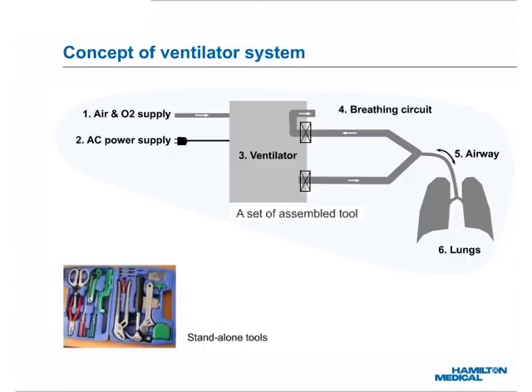The ventilator, therefore, is just one of the parts required for ventilation. It can be compared to a wheel of a bicycle. If not properly integrated into a system, a ventilator alone can do nothing about mechanical ventilation. This might appear surprising or confusing, but it is so. It is critical for all who are involved with the business of mechanical ventilation to understand the concept of ventilator system.